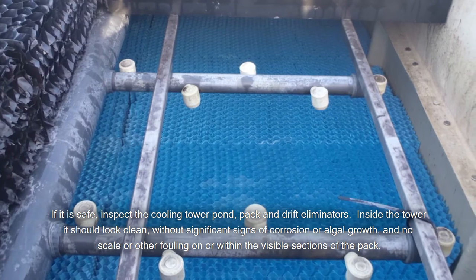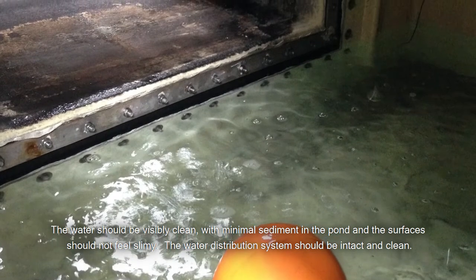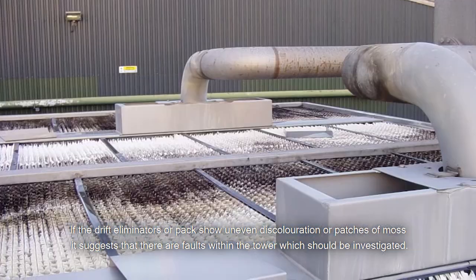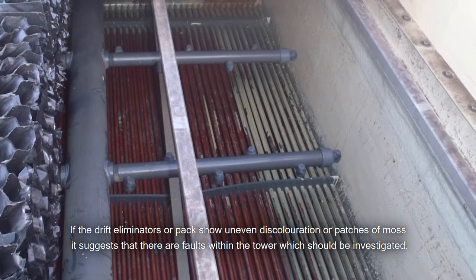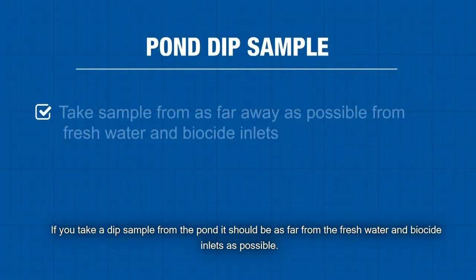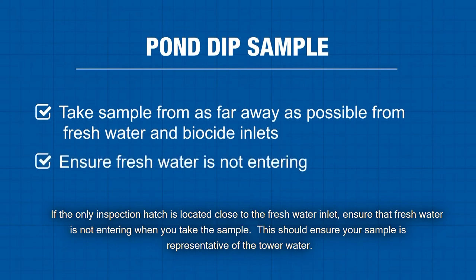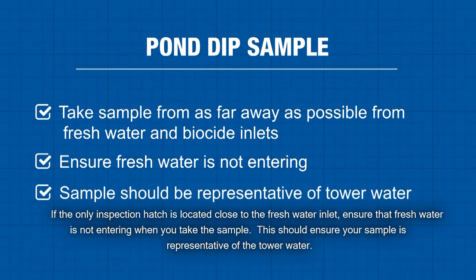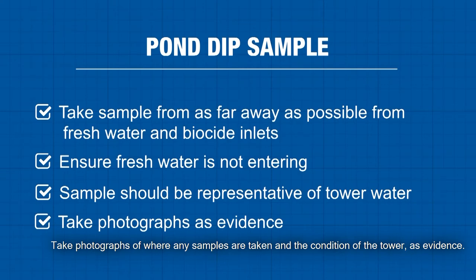Inside the tower it should look clean without significant signs of corrosion or algal growth and no scale or other fouling on or within the visible sections of the pack. The water should be visibly clean with minimal sediment in the pond and the surfaces should not feel slimy. The water distribution system should be intact and clean. If the drift eliminators or pack show uneven discolouration or patches of moss, it suggests that there are faults within the tower which should be investigated. Take photographs of where any samples are taken and the condition of the tower as evidence.